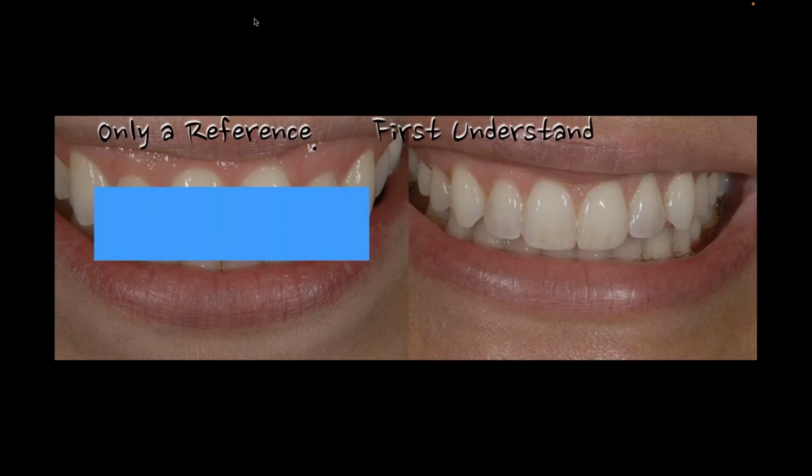Now, I do also know, especially with some of the doctors I work with today, I hear all the time, patients don't want any color, they don't want any orange or yellow, and I get it, and we have to try to stay away from some of those. At the same time, they do need something. They need something that's going to be there to add a little warmth and a little more translucency, so it creates depth and it doesn't look exactly the same as the middle third of the tooth.